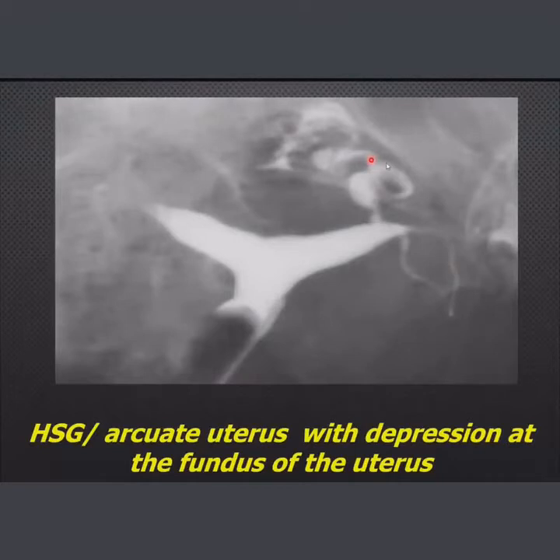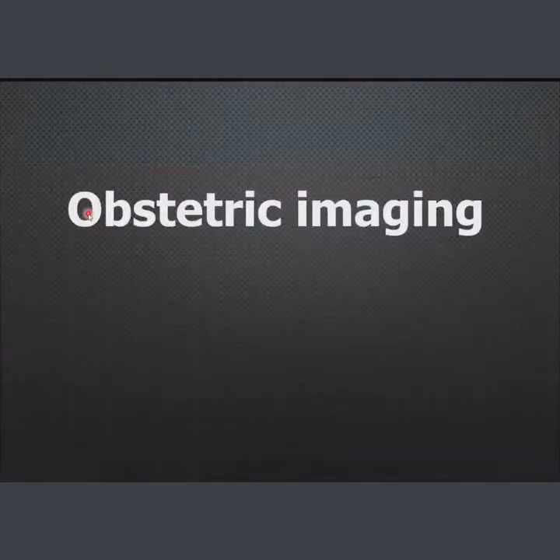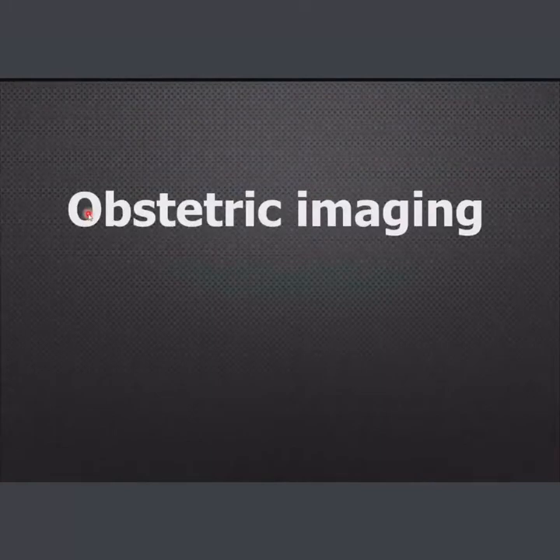أشوف هذا اللي هنا الكونتراست اللي دا يطلع من هذا الـ tube لاحظوا أنه هذا الـ tube is patent ودا أشوفه كله وأكو spillage للـ peritoneal cavity from the tube while this tube is blocked. I cannot visualize the tube and I cannot see spillage. طبعا sometimes this investigation has also therapeutic benefits. يعني ممكن أنه it can open the tube obstructed by adhesions or patients might conceive after this procedure.